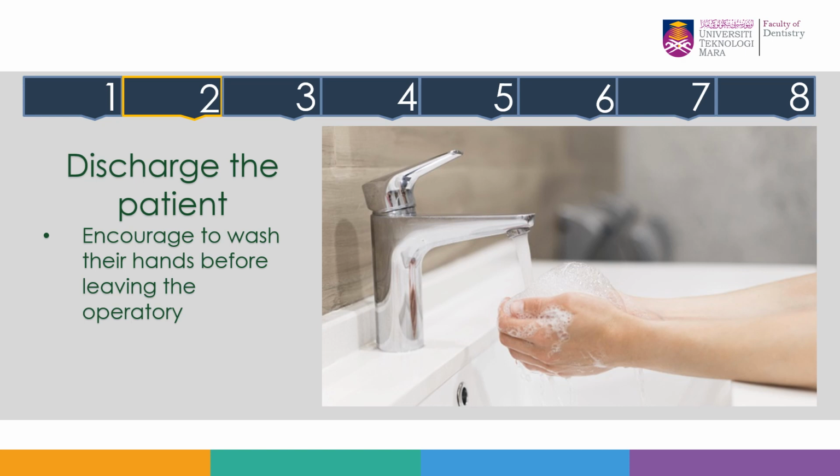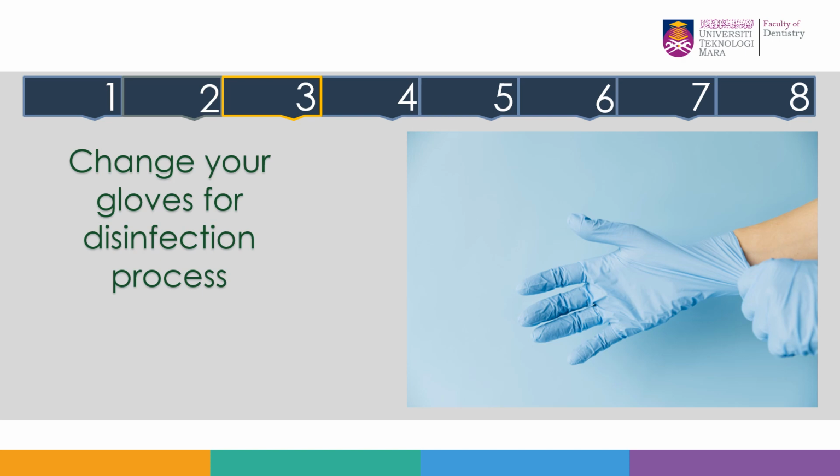Okay, once you discharge the patient, the patient can be encouraged to wash their hands before leaving the operatory, because they might touch several surfaces upon entering the dental clinic and during the dental treatment. So just get them to wash their hands before leaving the dental operatory room. Change your gloves. So you have to throw the gloves that you used for the dental treatment and put on a new glove for the disinfection process of your operatory room.